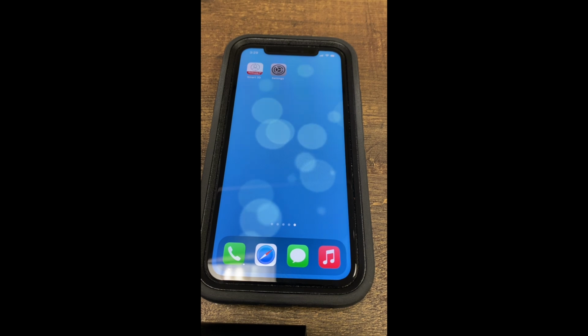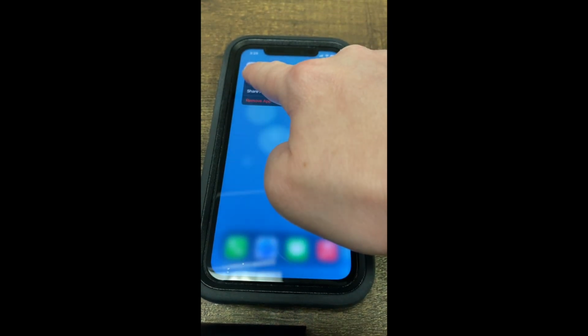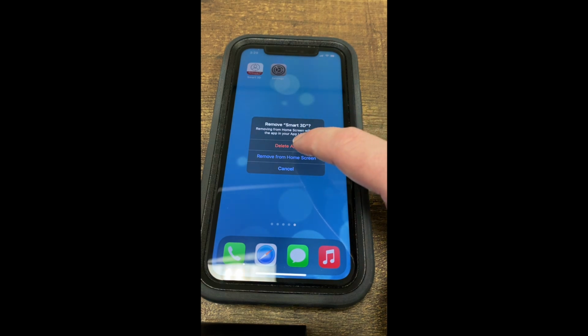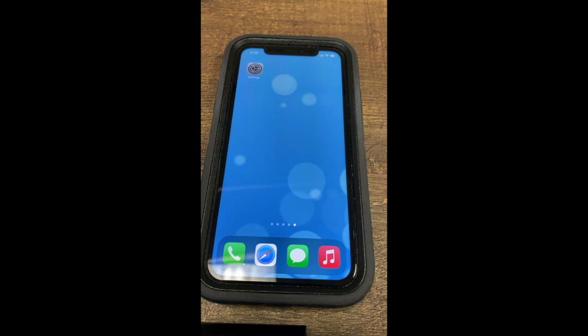Secondly, if that does not help, then what you would want to do is go ahead and reinstall the app. So how to do that? You would go to the Smart 3D app, just press and hold the app. A screen should pop up and you would say remove app. You would want to say delete the app, and delete. Now the app is deleted. Then you would go into your app store, re-download the app, and then reinstall the app to the phone.